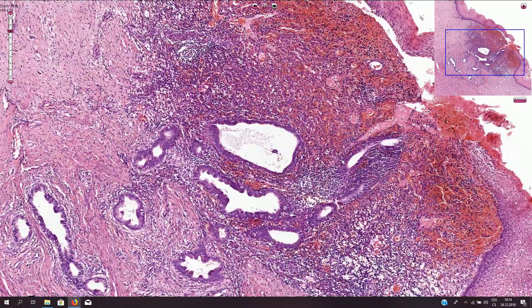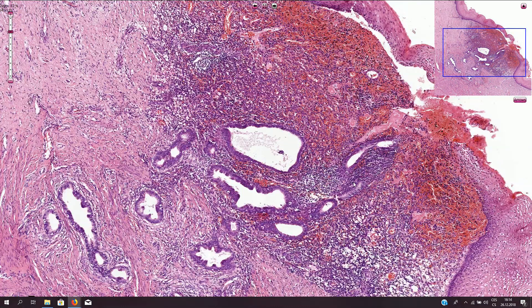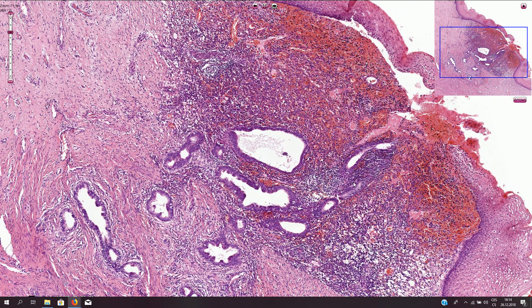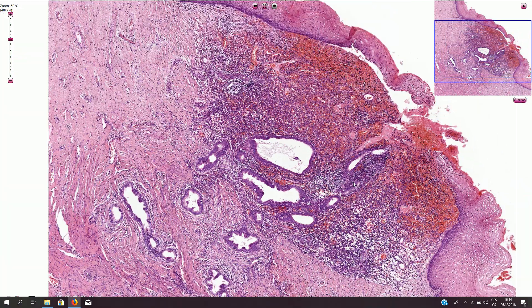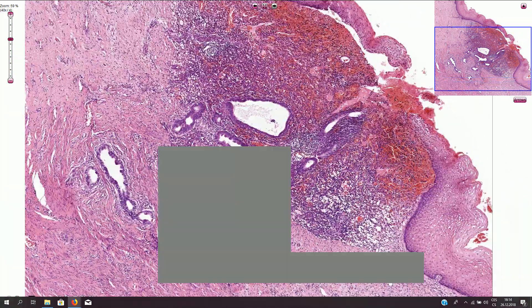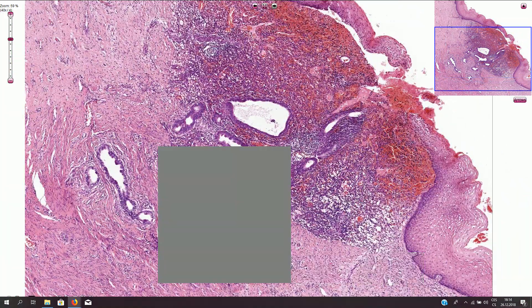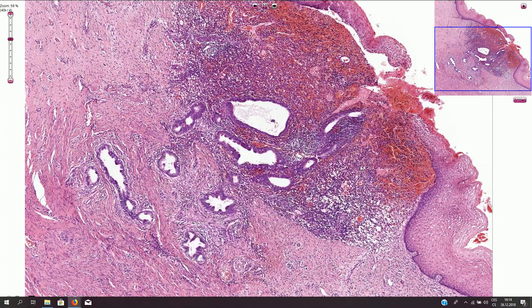Endometriosis can be found in multiple tissues and multiple organs, so this is an example of endometriosis of the cervix.